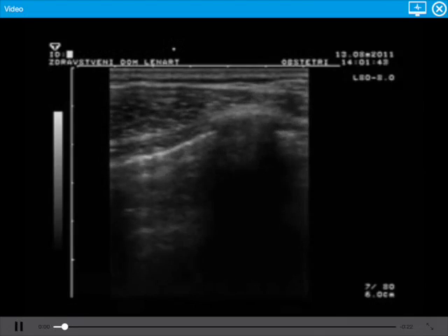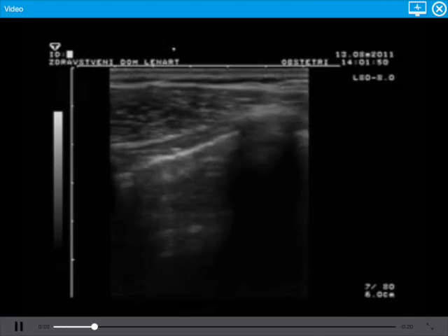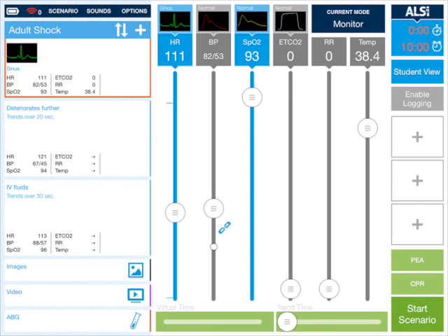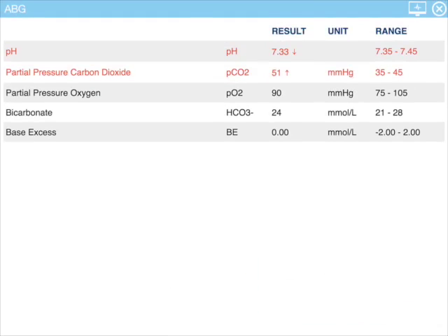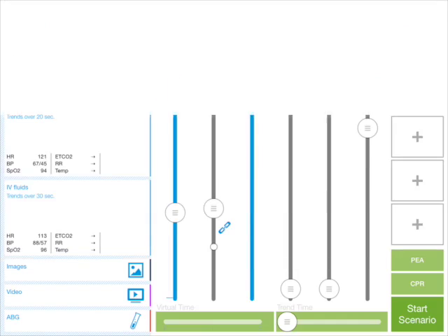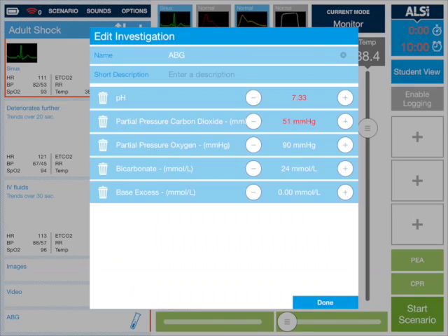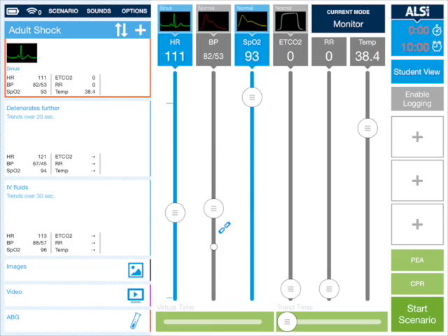There's the video, and it plays automatically — it will play automatically on the student screen as well. There's the investigation. If you want to edit the investigation on the fly, you tap and hold it, and you can go into that screen. So we'll just add a base deficit there as well. Done.